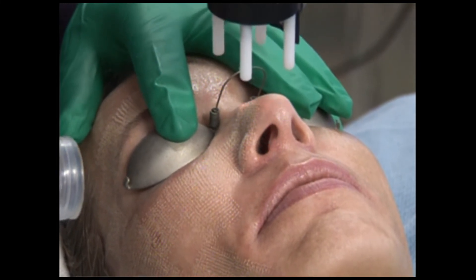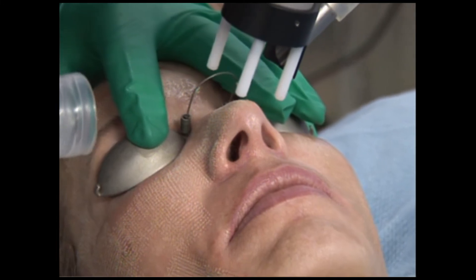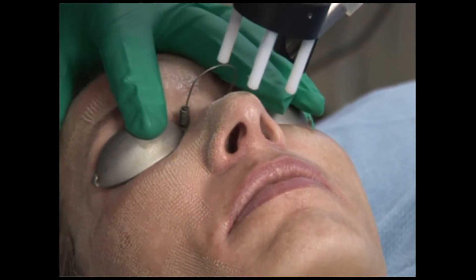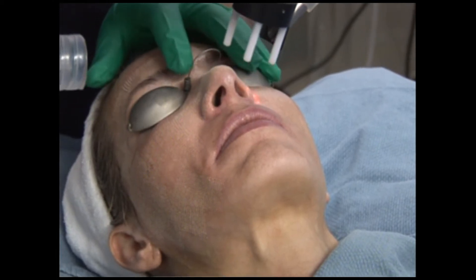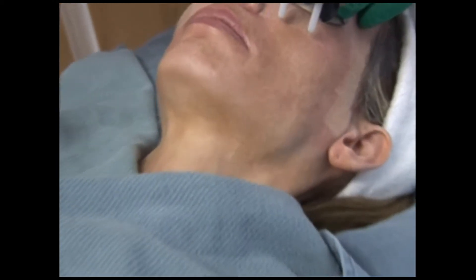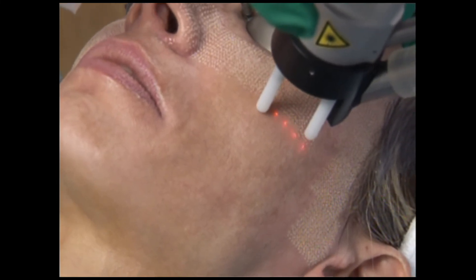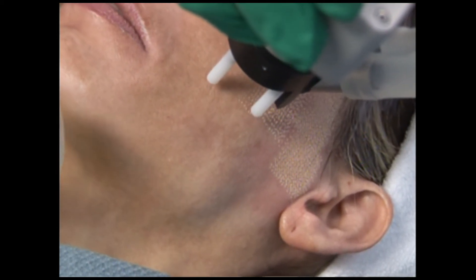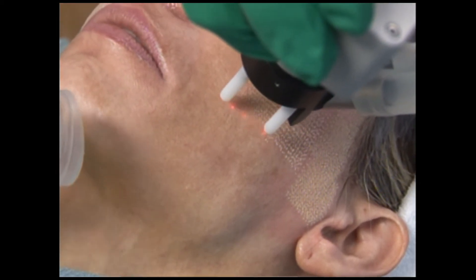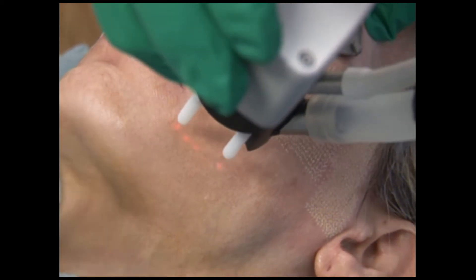Now I'm going to change the pattern of the laser to come across the nose. This laser lets me do that without really pausing the treatment. We'll use two passes because there is this pattern of dots, and to minimize the chance that the pattern becomes visible on the skin afterwards — which can happen, especially with melasma patients — we try to overlap it a little bit.